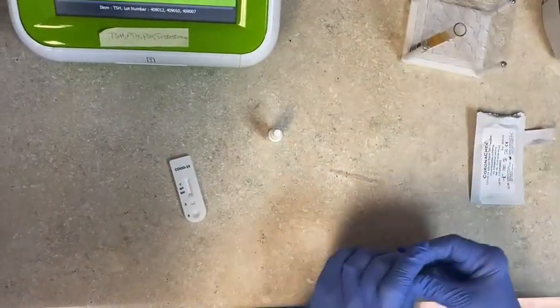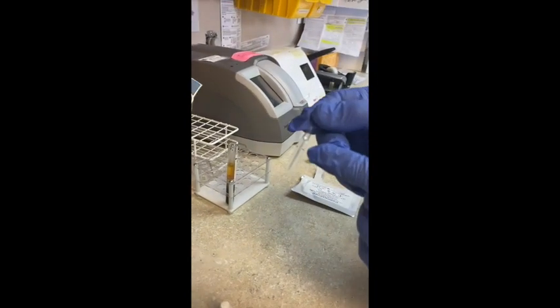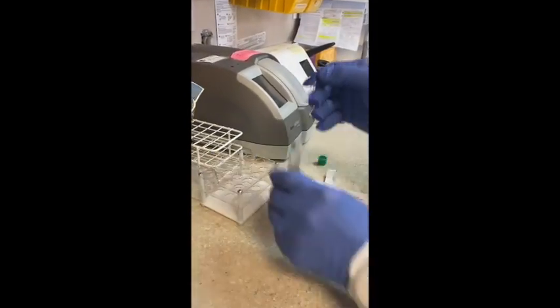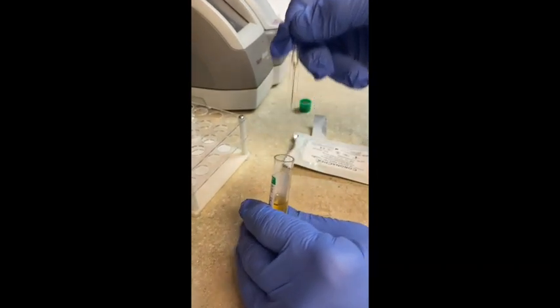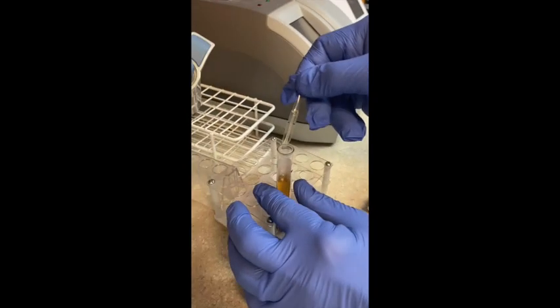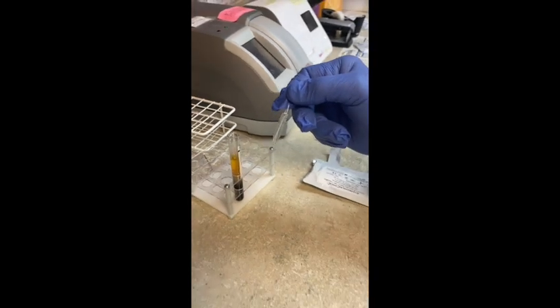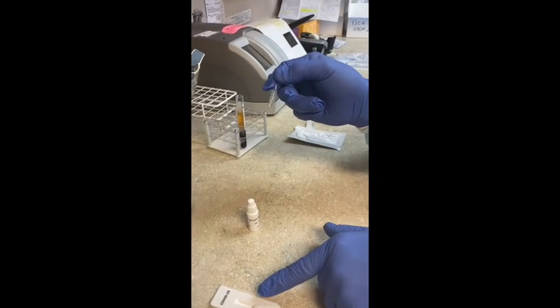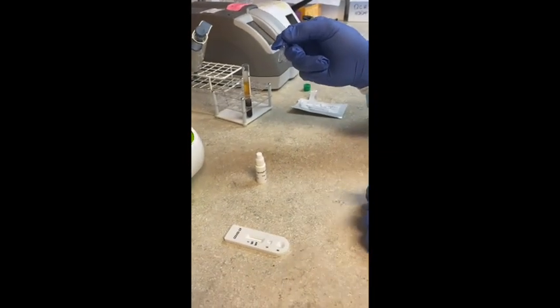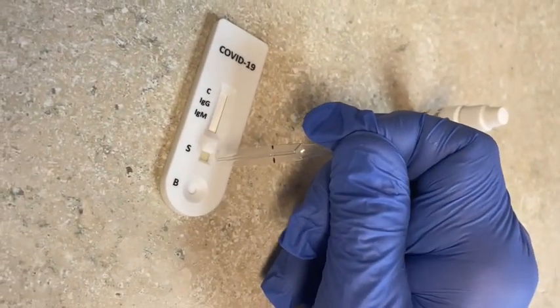Take the lid off. With the micro pipette, you're going to suck up the serum up to the black line. When you suck it up, you can actually draw it up into the well above, then just push down to the black line. Put the plasma into the well labeled S for sample — squeeze that in, and you'll see that it's yellow.